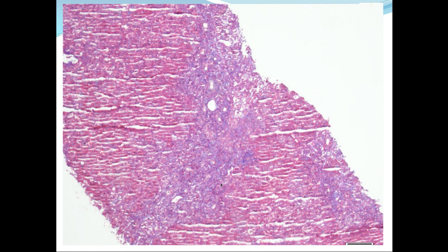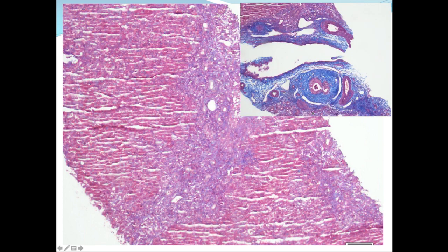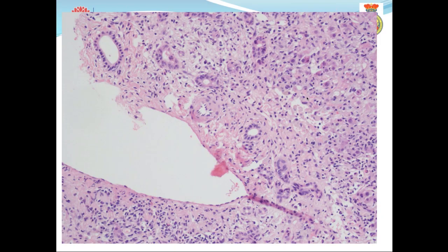Also, the trichrome stain. I use as an internal control the collagen layer around ducts and in the portal tracts, and you can see in these areas of necrosis that it has this fluffy pale blue appearance rather than the dense appearance you see in true fibrosis. So important not to overcall this in these cases.